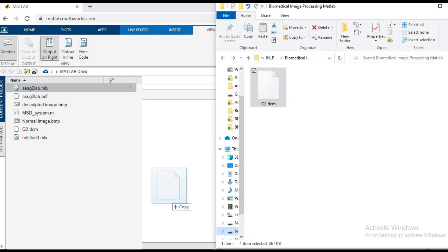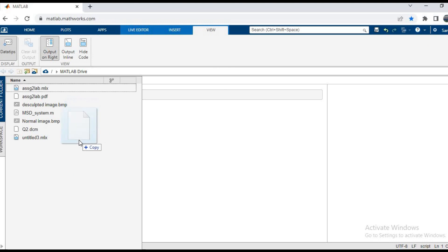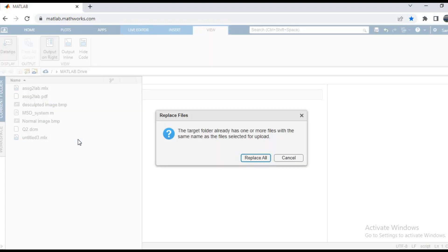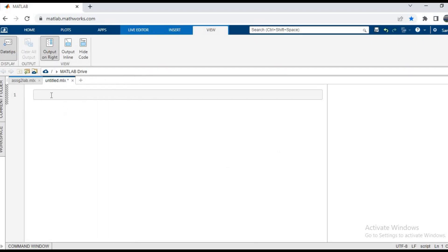So now I already have these folders, so it is showing replace all. I will click cancel and then start. So basically, to read any kind of image, we have two functions: imread and dicomread.